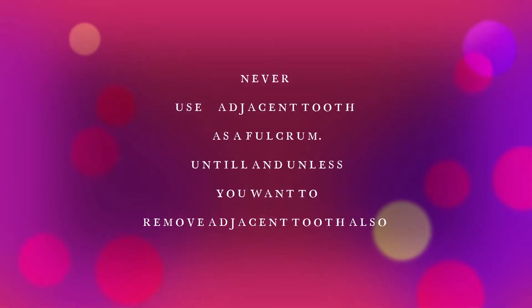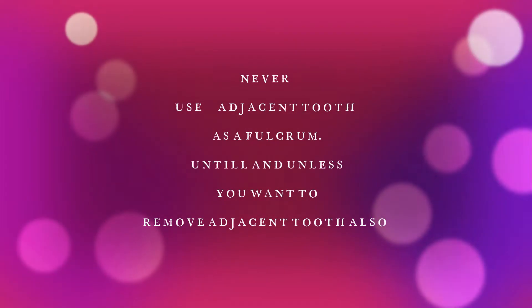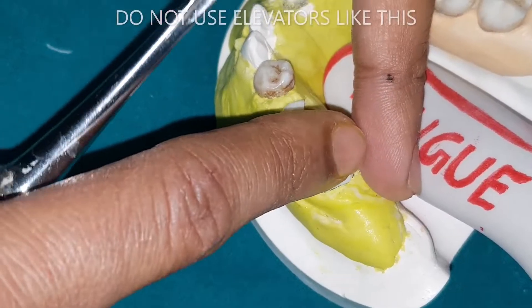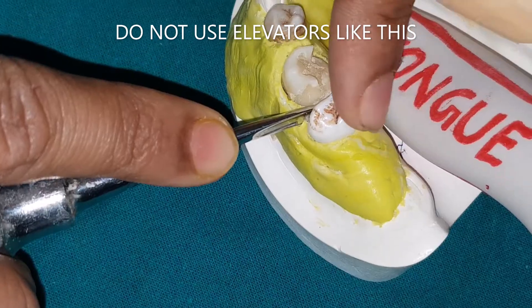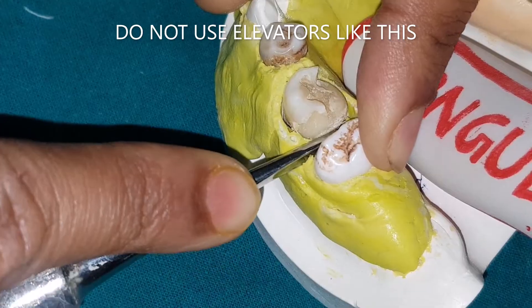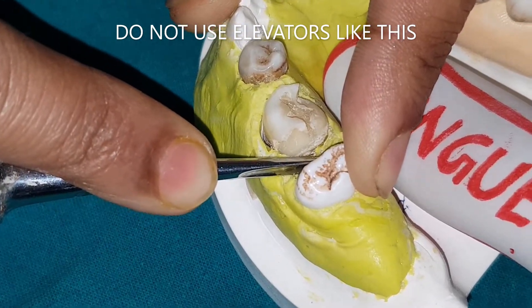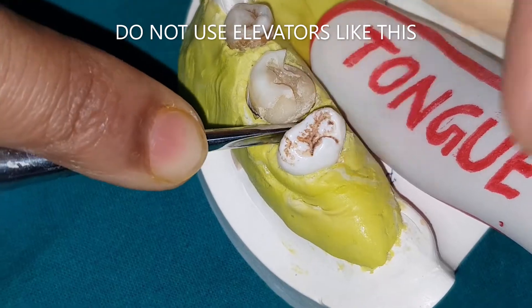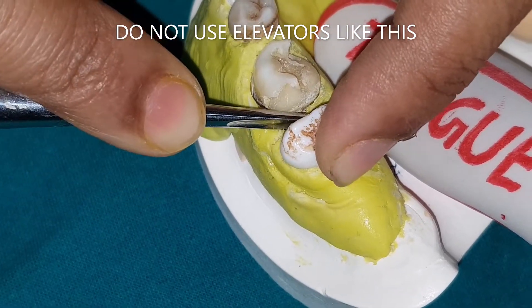Never use the adjacent tooth as a fulcrum unless you also want to remove that adjacent tooth. Never take support from the adjacent tooth — never do like this. This will generate excessive forces to the adjacent tooth and both teeth will get extracted. Only if you want to remove both teeth can you do this.